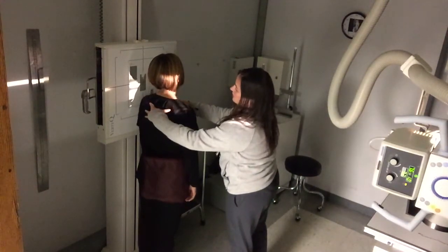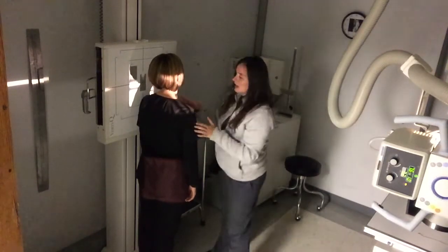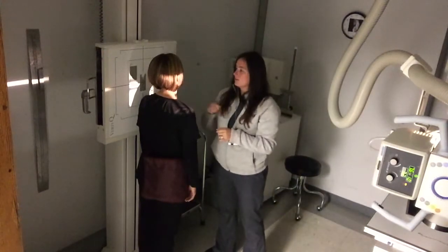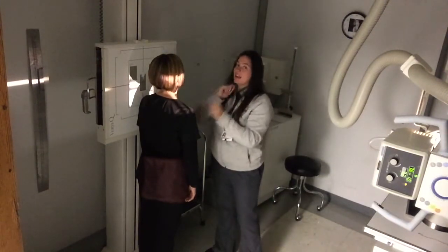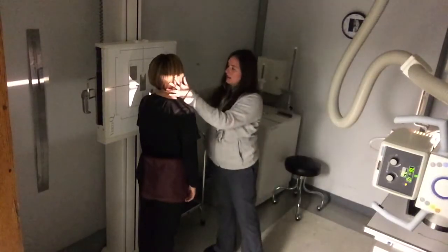I'm going to make sure she's really nice and lateral. This is very important for this one. And typically I also, just to make sure I'm not in the way of C1, have my patient give me an underbite if they're able to. So they bring their lower teeth out in front of their upper teeth, and that will pull their mandible away from C1, as well as kind of lean in the back.